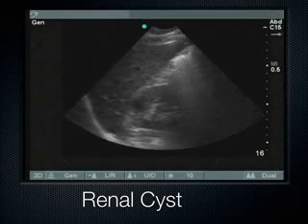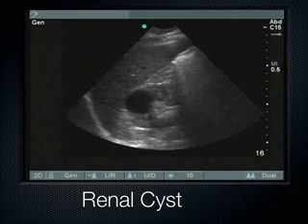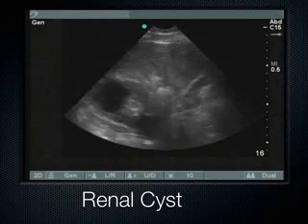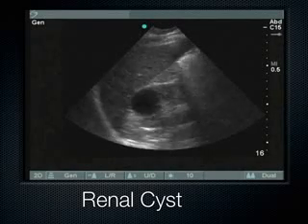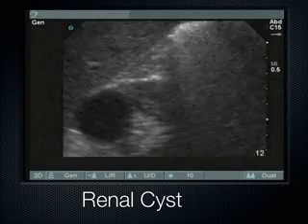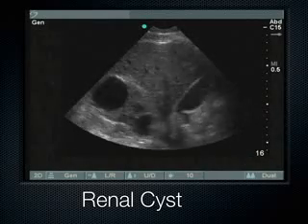This is an example here of a renal cyst. Notice that it's out in the cortex of the kidney. This is the liver. This is the kidney. We're losing the lower pole from all this bowel gas. But as we get out, we can actually see a cyst up here, and then there's another little cyst down here. Here's that cyst towards the upper pole over here. And no matter how you rotate the probe, from transverse to coronal, the cyst is always spherical and anechoic in all planes.